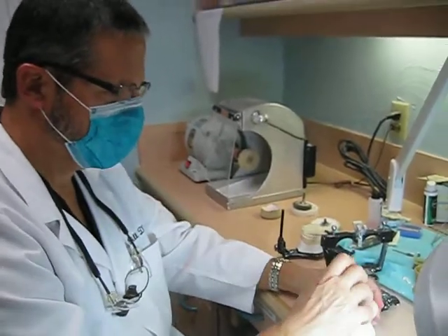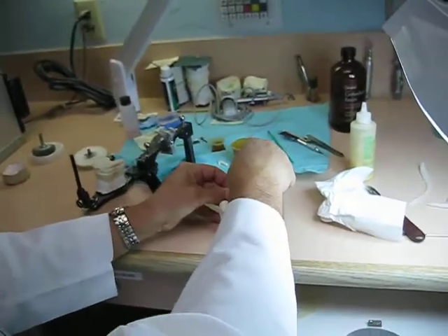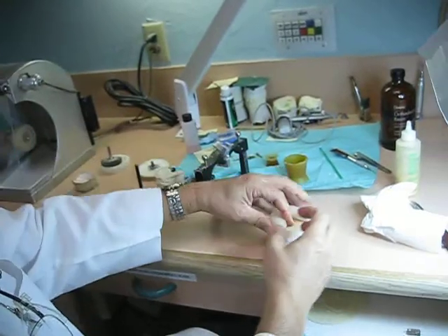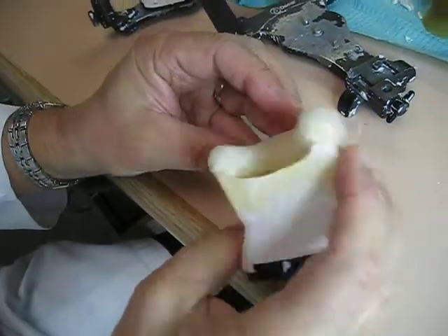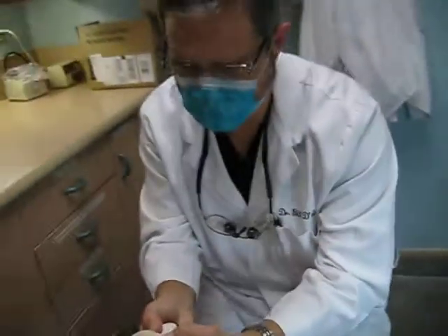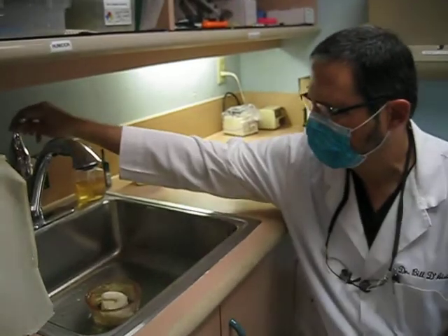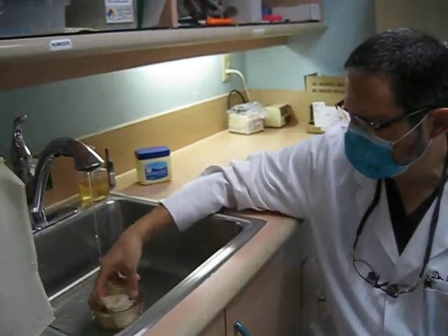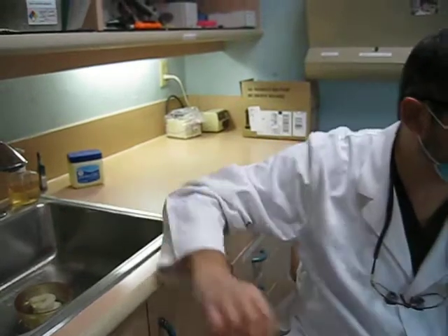So now it's getting to a point that it's lost its sponginess and it's getting really warm to the touch. So now it's lost its springiness, but as you can see, it's conformed pretty well to the model. And now it's so hot and it's not moving, I can't do anything more with it, but now I put it back into a water bath of cool water to slow down the reaction, because keeping an exothermic reaction from overheating means you have less distortion in the final product, so it will snap on in place in the person's mouth, which is what you want. You want it to be able to snap in and then lightly snap out.